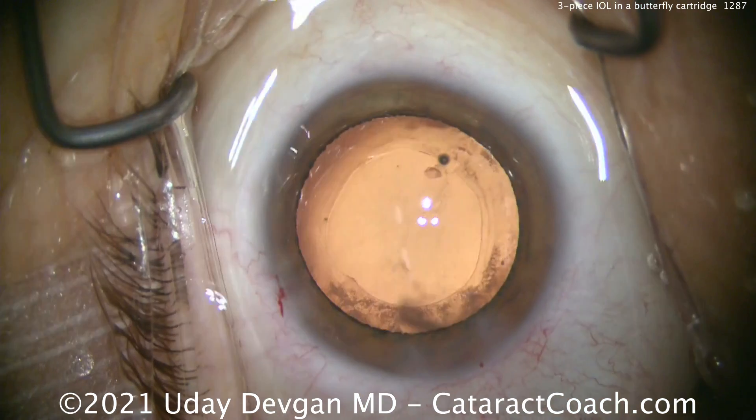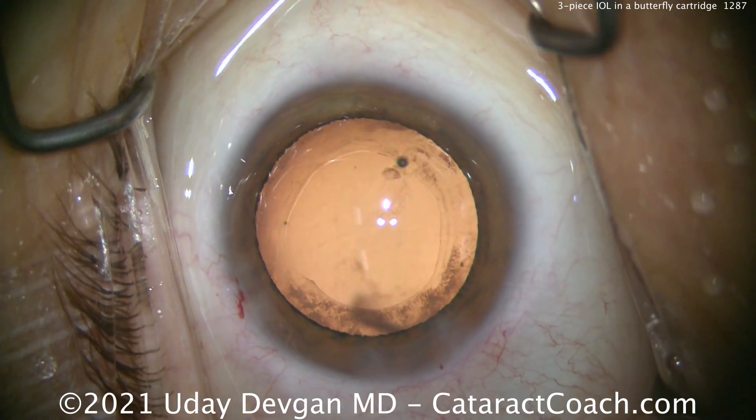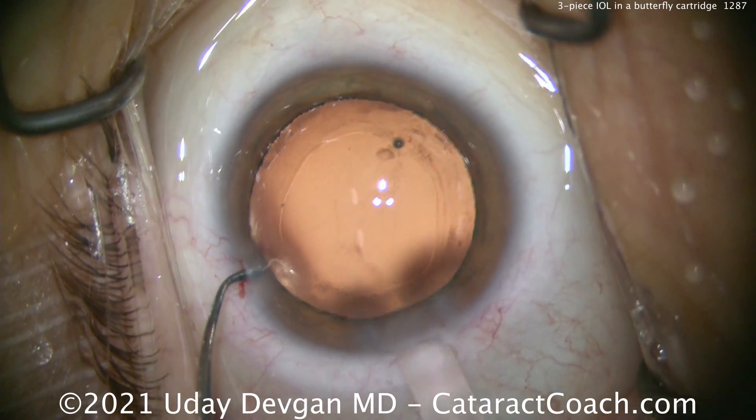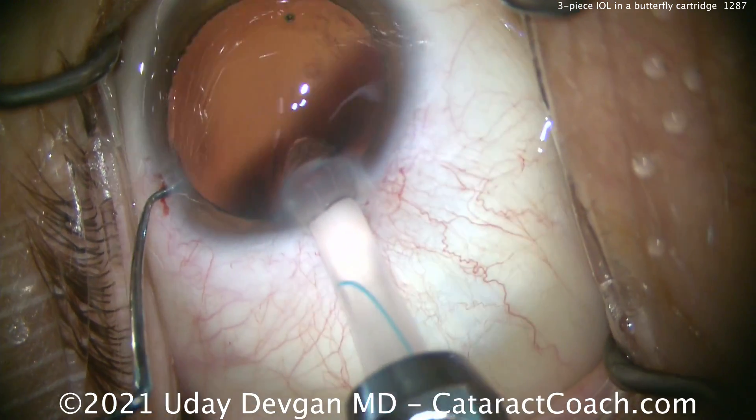There are directions for use from all these manufacturers where you can learn how to load these lenses. You can ask the rep to help you, or watch these videos. We're going to polish up the capsule bag after I get the lens into the bag.